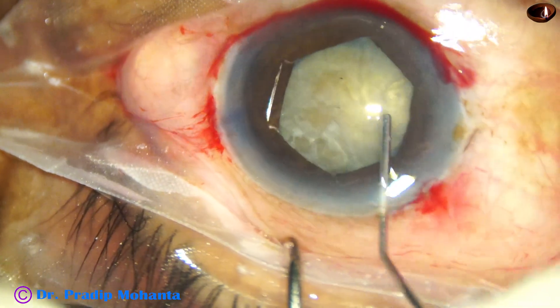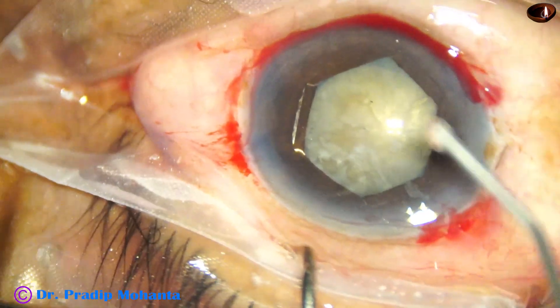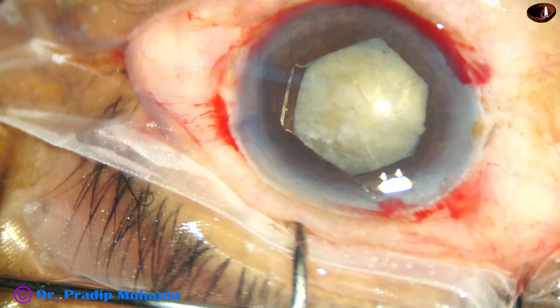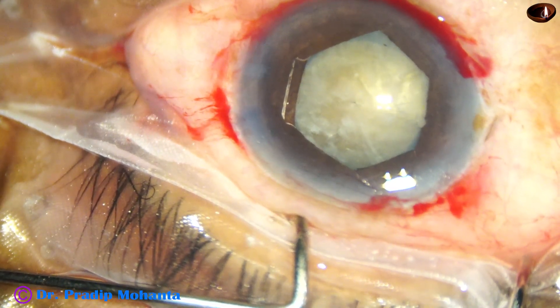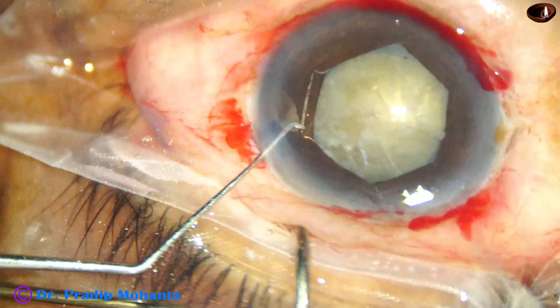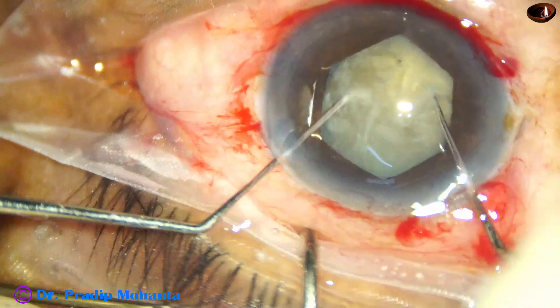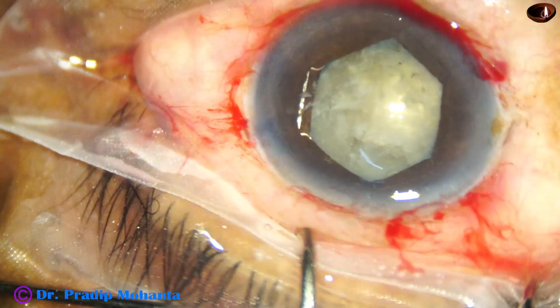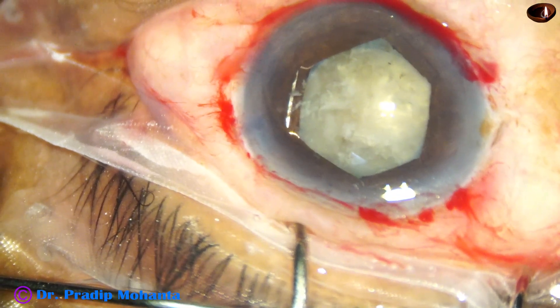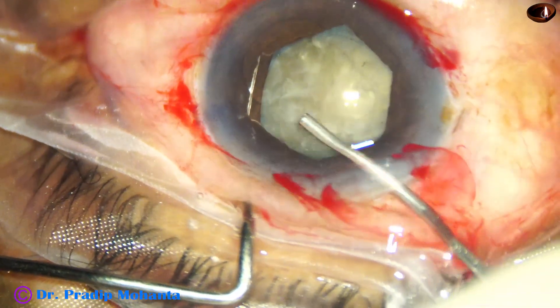It is enough to manage a case. B-Hex exerts the least amount of stress on the sphincter, so damage to the sphincter pupil is least with this device. At the end of surgery the pupil is round and central in most cases. Bimanual rotation of the nucleus has been done.